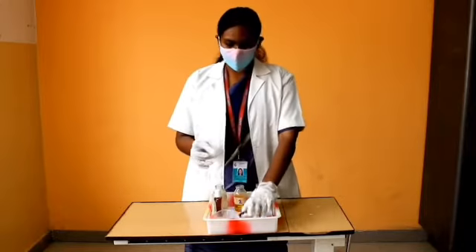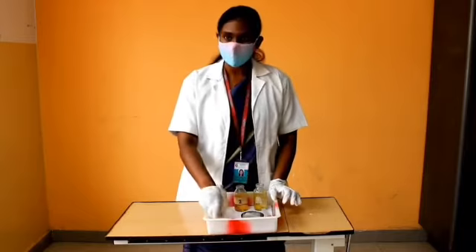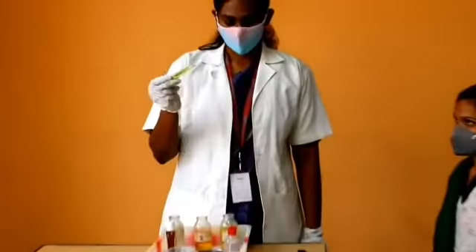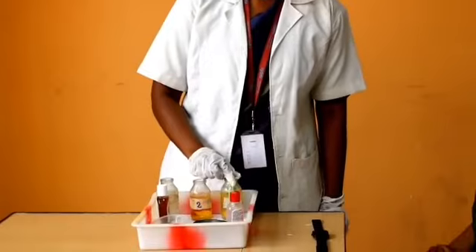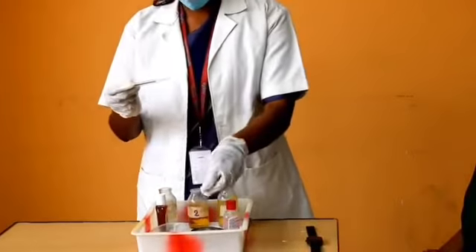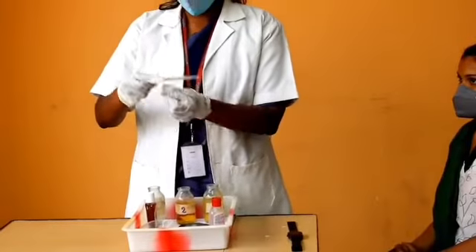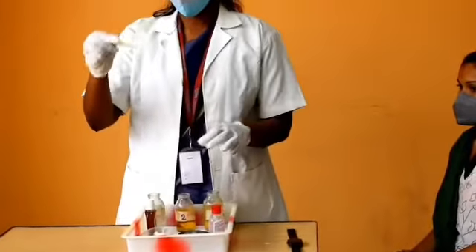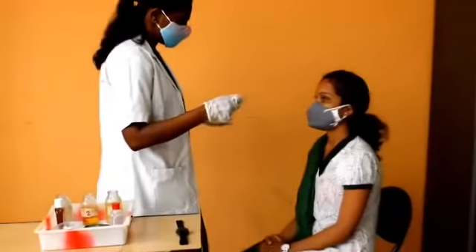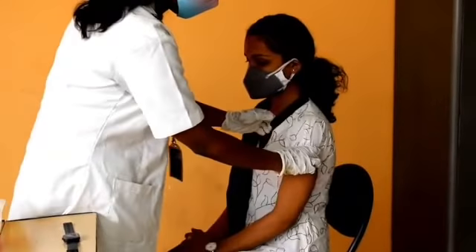We also need cotton balls and a kidney tray. First, take the thermometer and dip it in the first solution — Dettol solution at 1:40 ratio — for some minutes. Then wipe it down from bulb to stem, from less contaminated to more contaminated area. Then place the thermometer in the axillary region between the two skin folds of the armpit.